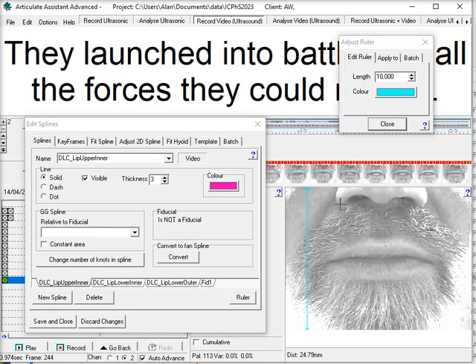Once we've stretched that cyan line, then in this little dialog we tell the software what the real world distance covered by that cyan line is. Now we've done the measurement and it's 70 millimeters, so in here we'll just type 70. So this will do the scaling.